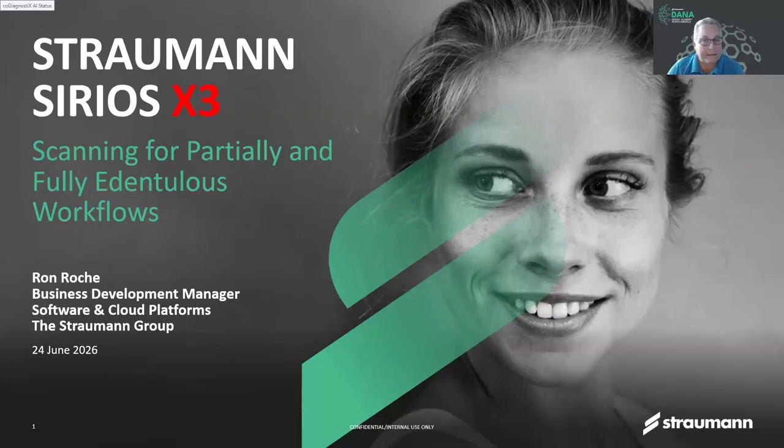That is such a broad category. Everything from that first patient who presents edentulous and needs a new denture to a patient who has a denture and just needs a remake, a patient with a partial that needs to add a tooth to the partial. There's a lot of different scenarios in this.